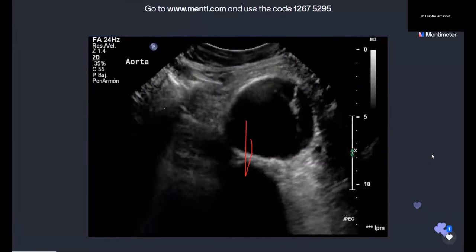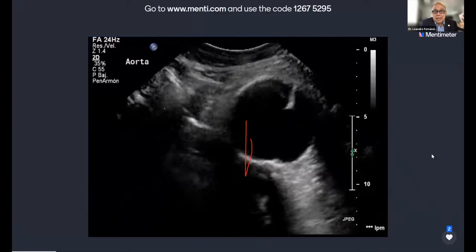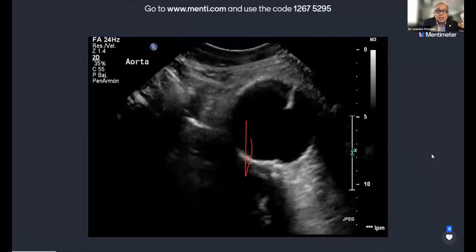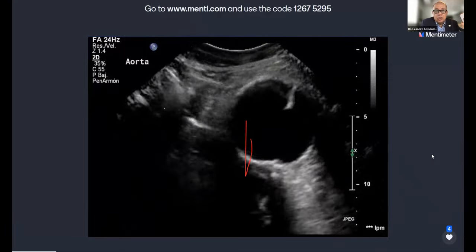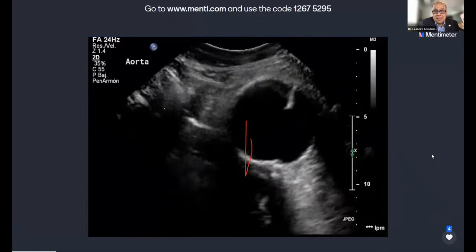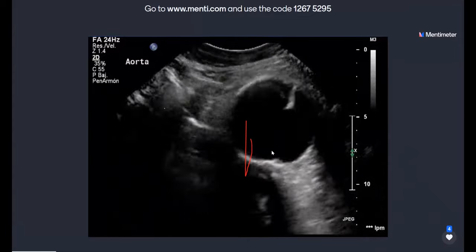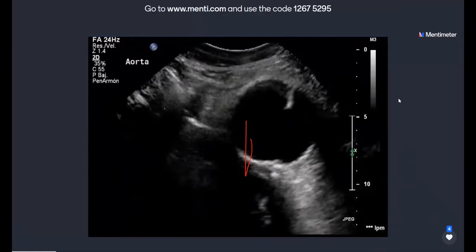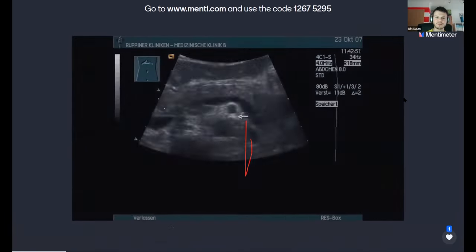Yes, we are seeing here a triple A, an abdominal aortic aneurysm, in transversal. The image also shows plaques in the posterior wall. The aorta is dilated, and we can observe parietal thrombus, also thrombosis. Okay, perfect. So we go on to the next one.